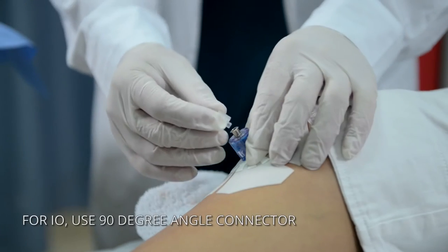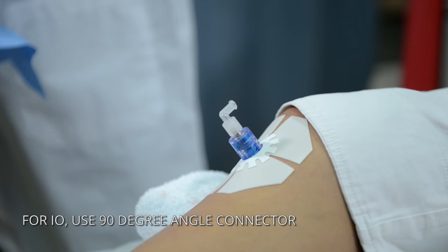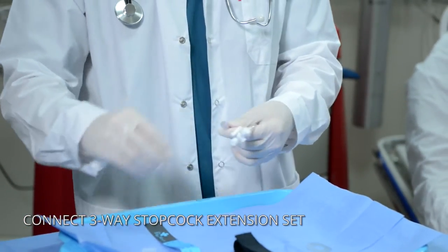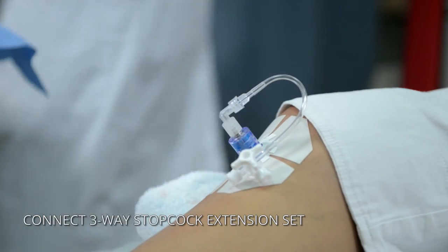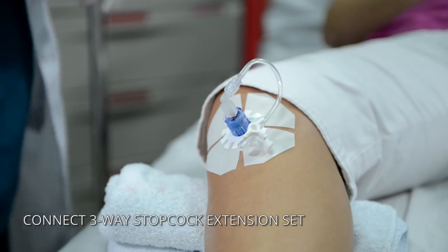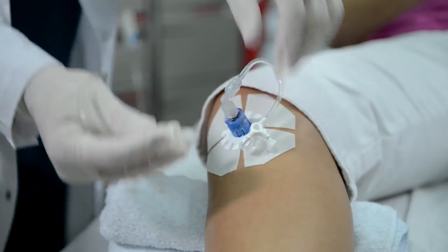The GO-IO has a unique extension set with a 90-degree angle Lorelock connector. This enables the kit to work with both I.O. and I.V. lines. The extension set consists of a three-way stop-cock, which allows simultaneous administration of medications, fluids and blood products. This unique set prevents kinking of the line and allows for uninterrupted flow.